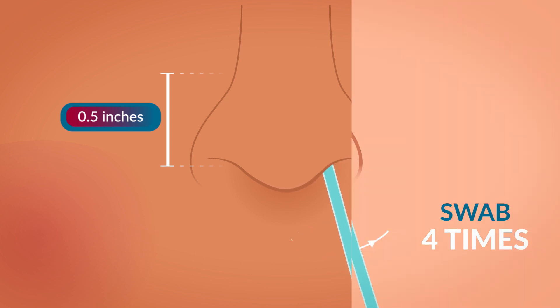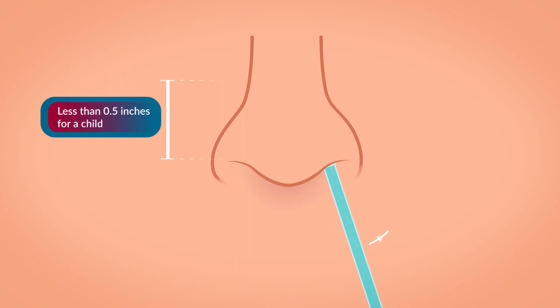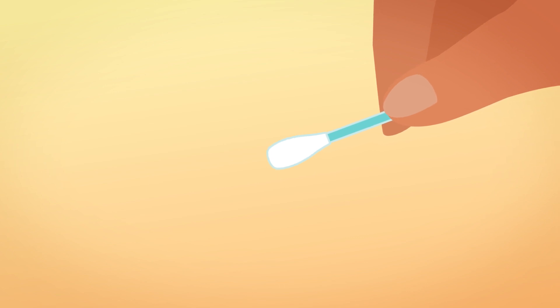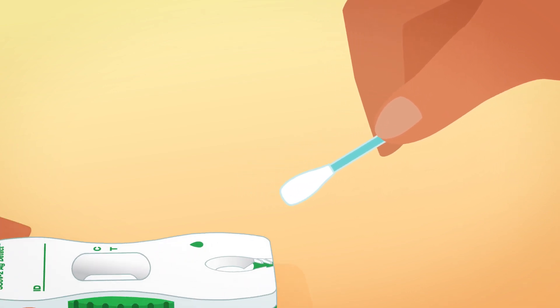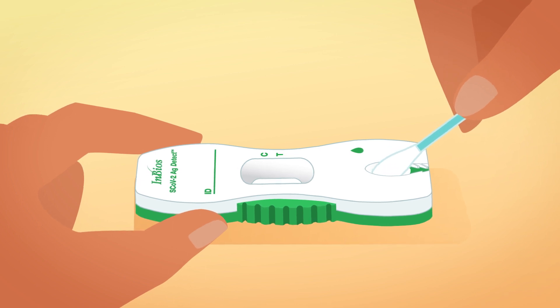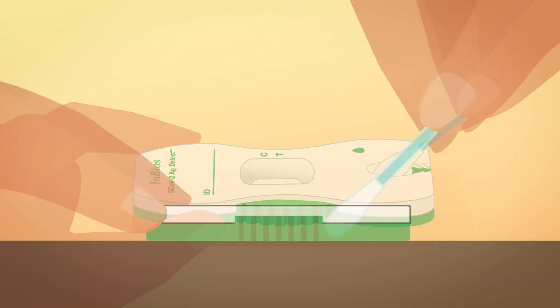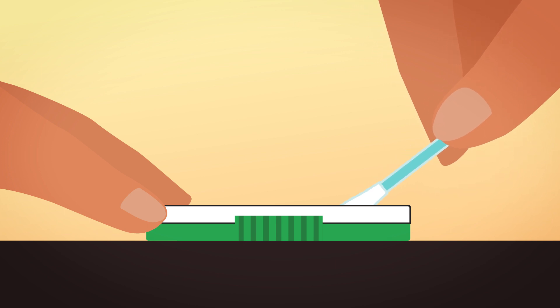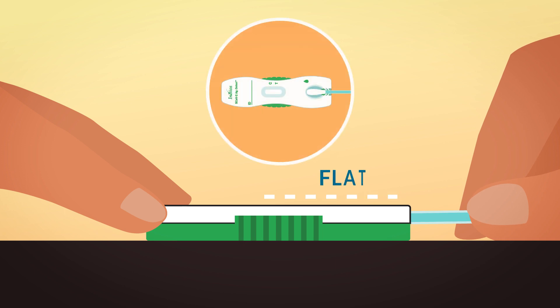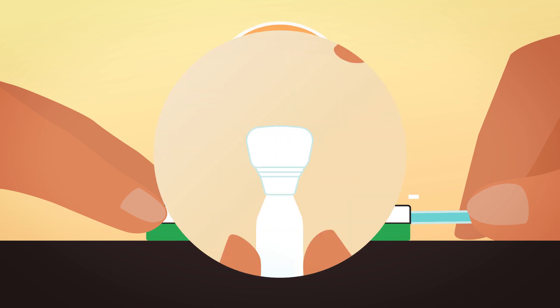Be gentle. When swabbing a child, you might not need to insert the swab as far. Once you have your sample, it's time to run the test. Hold the top of the cassette firmly with one hand and place the swab tip into the sample port. Hold the swab close to the tip so it doesn't break as you're inserting it. Gently push the swab tip into the sample port while pressing the swab handle down. The swab should be flat and cover the sample port completely.